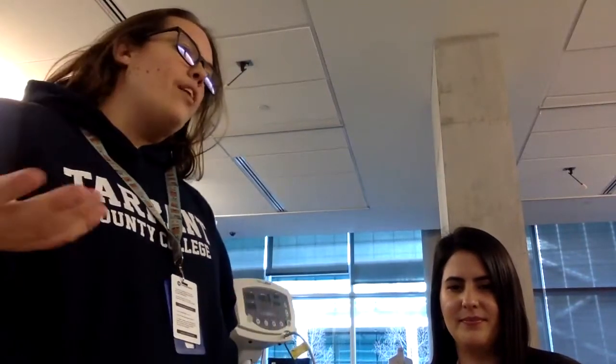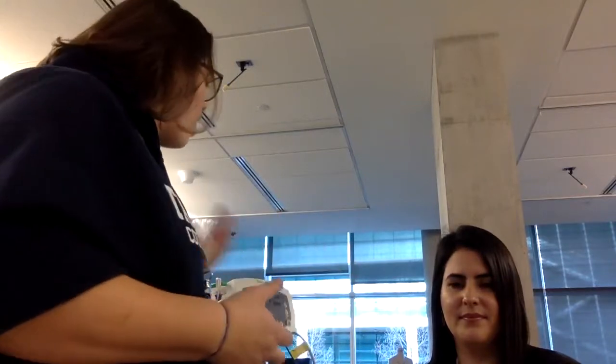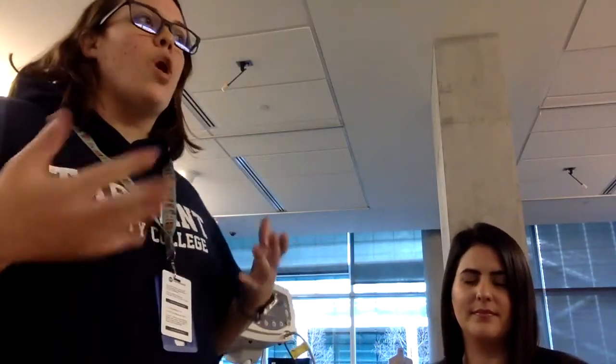Hey guys, so it's Ms. B and Professor Woodruff, and we're here to show you how to take vital signs. A lot of times people may see this as something for the tech to do, but you may work at a hospital that does not have techs. Also keep in mind that sometimes with certain administration of medications, or just as the role of the nurse, you're going to need to know how to take them. We have our vital signs machine here, but there may be a different look depending on your hospital — you can always ask a tech or nurse on the floor. I really just want to teach you the basic principles of vital signs.